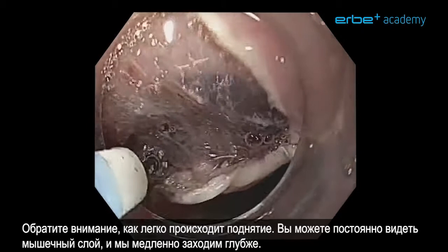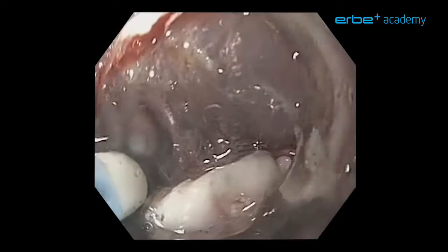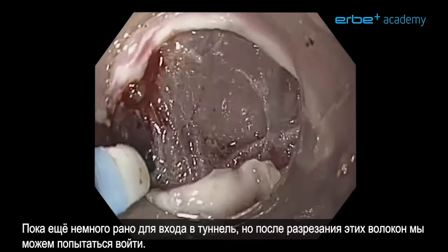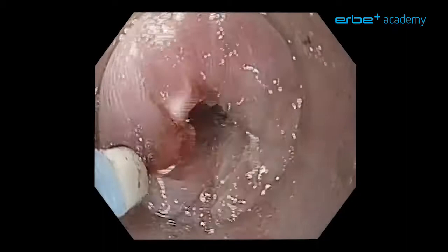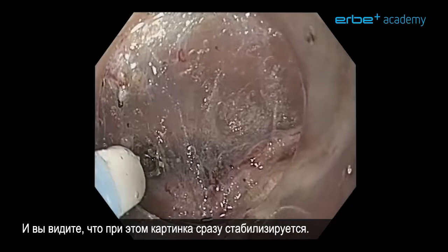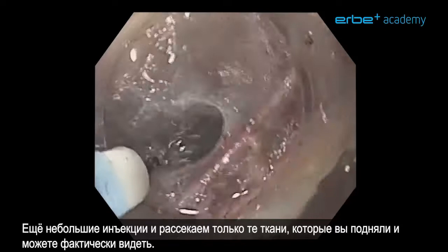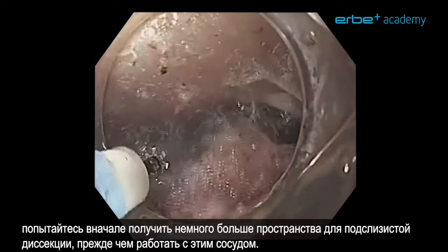Notice how easy this lifts. You can at all times see the muscle layer and slowly we are digging ourselves in. It is still a little bit too early to go into the tunnel but once we have cut these fibers as well, we can probably enter. Again, small injections — cut only what you have lifted and what you can really see. There is a large vessel on the right side — leave it for now. Try to get a little bit more clearance with submucosal dissection first before you attack this vessel.